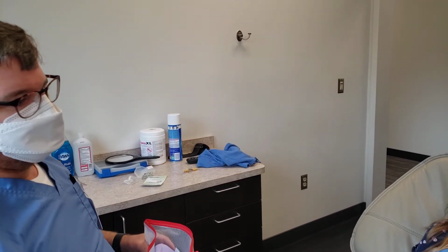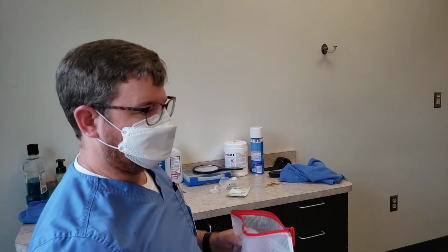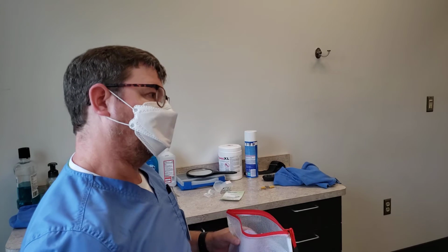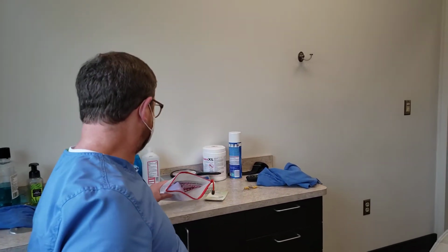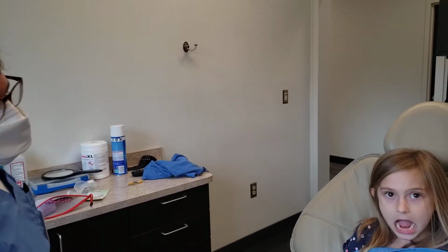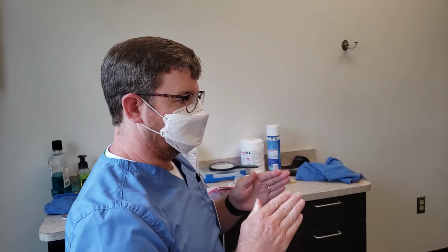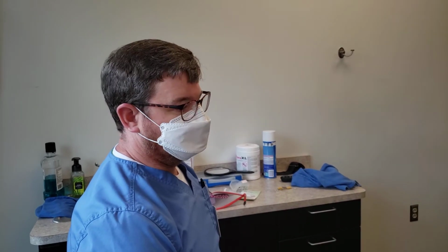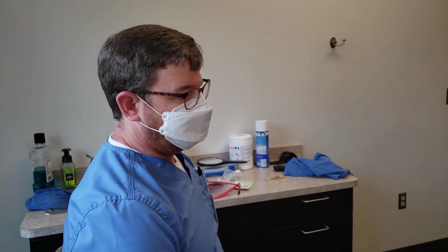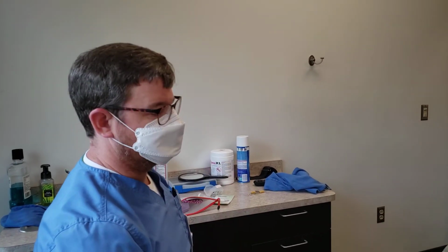Just 10 minutes. Their jaws are more pliable, and so the pressure on their teeth maybe doesn't feel as intense as teeth that have been in there for a while. And we've noticed her jaw's changed already. What happens is it's about 1 millimeter a month that you can change. Wow. And so essentially we're trying to recreate what the tongue would have done if it was strong enough and in the right position initially.